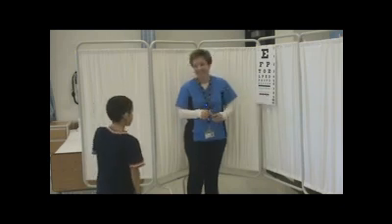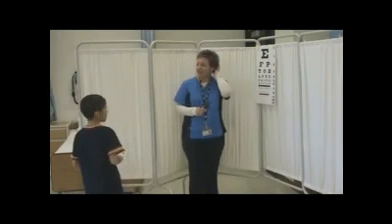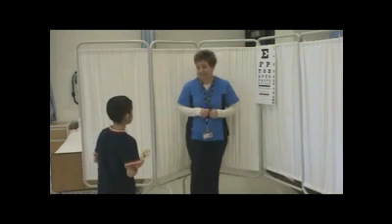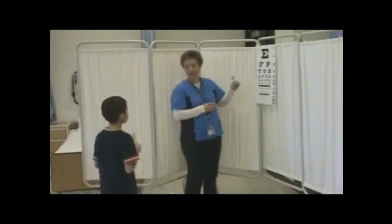Pretty small, eh? Okay, Matteo. Now, take a couple of blinks, give your eye a break. We're going to test both eyes together. Okay? Whenever you're ready.